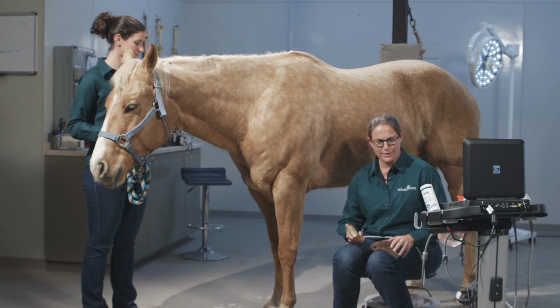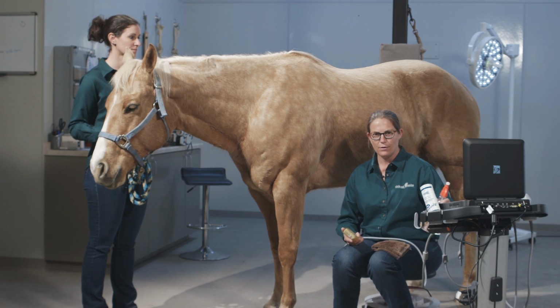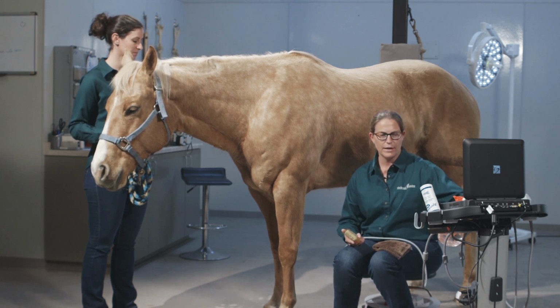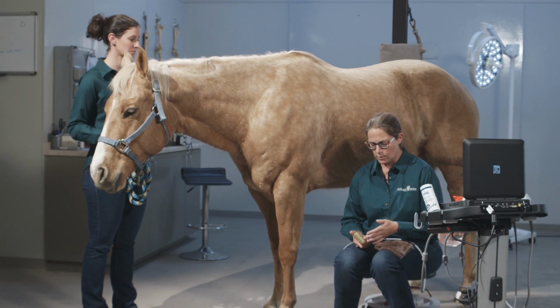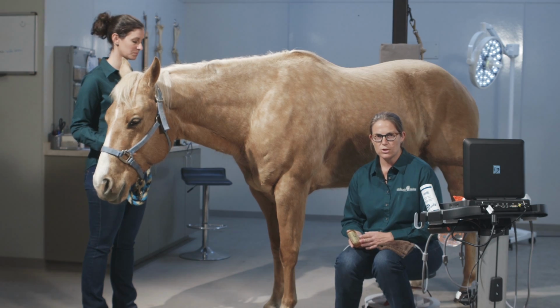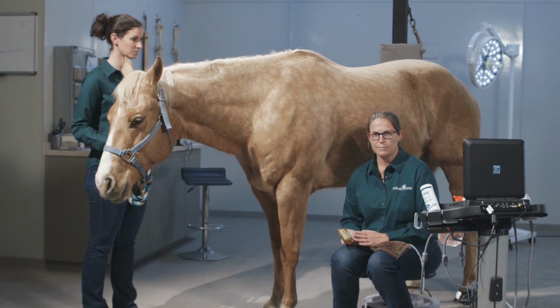When I'm using a standoff, I rarely use alcohol in combination with the standoff. I find that the rubbing alcohol over time dries out the standoffs. As well, I find that it doesn't add anything to the image quality when I'm using alcohol and a standoff. If I'm starting to lose image quality, I'll either add more gel or I'll rewash the leg and get rid of the gel that's on it and then start anew with fresh gel. And then in that type of situation, I get the best image possible.